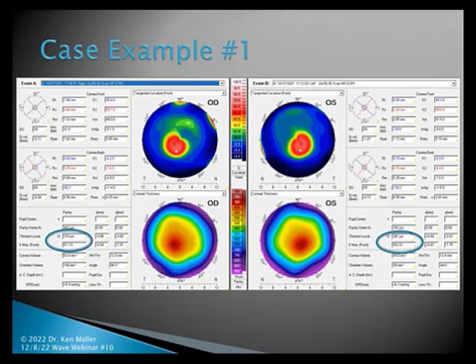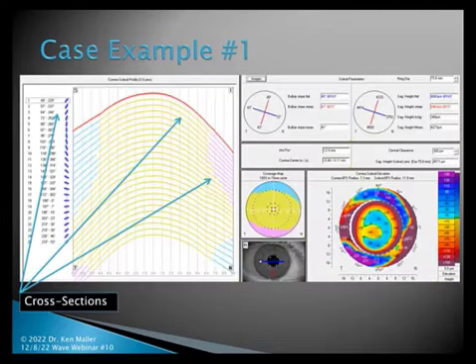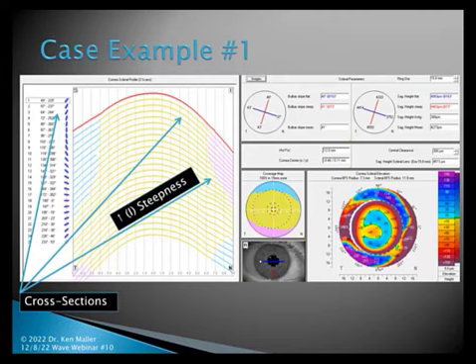This was the actual scan that I took of her eye that day. Once again, you can see the arcs of cross sections there. I've pointed inferiorly to that set of pink arcs at the very edge, and you can see how quickly they're approaching the lower portion of the screen. They're really heading more straight down than, for example, the turquoise arcs on the left-hand side.